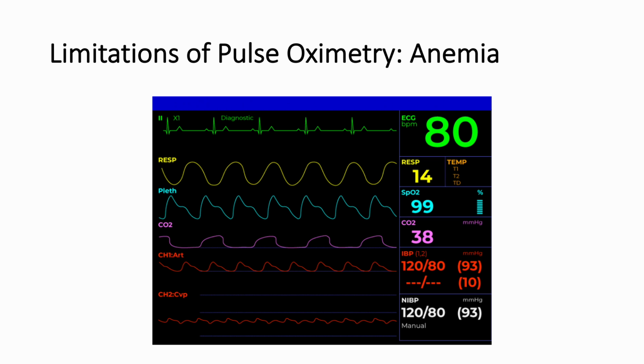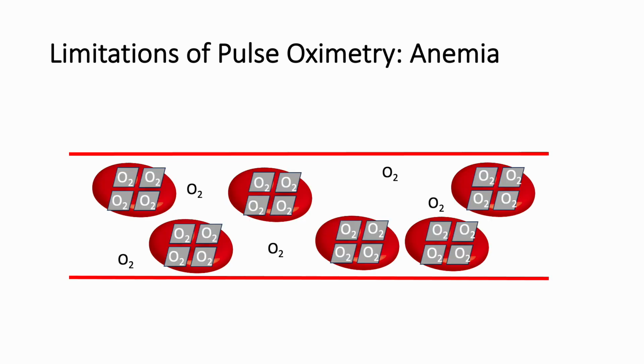And we then usually extrapolate these results to the patient as a whole. From time on the unit, we're all used to striving for oxygen saturations of at least 90 to 92 in most patients without pre-existing lung disease, or within an 88 to 92 range for those patients with certain pre-existing or ongoing lung pathologies. We strive for these ranges because we generally consider them safe, and more specifically, we generally consider the ranges adequate to keep patients out of anaerobic metabolism, which we know is hazardous.